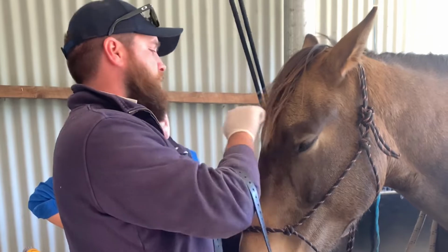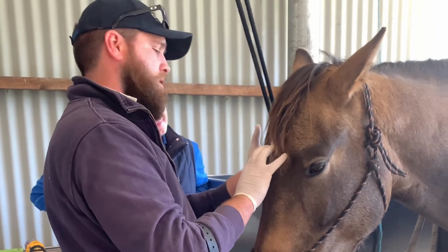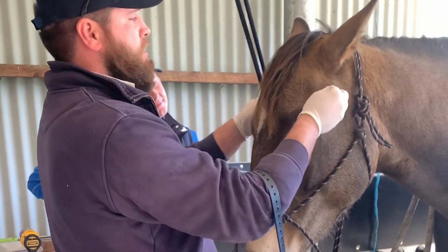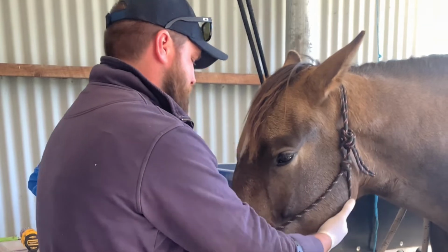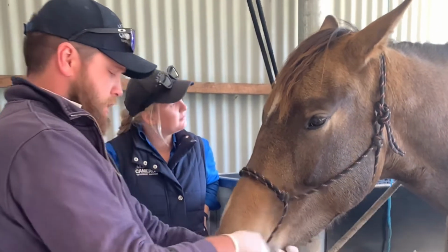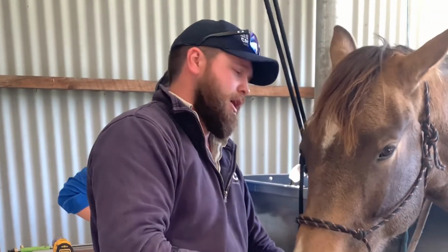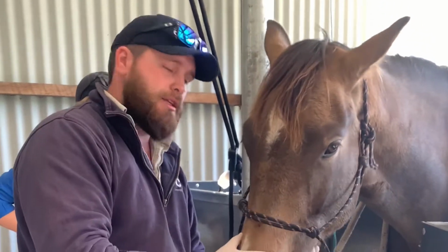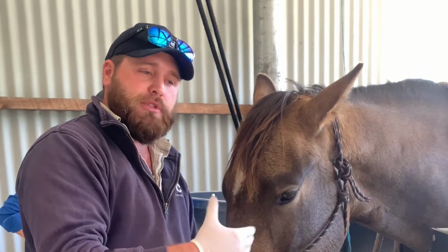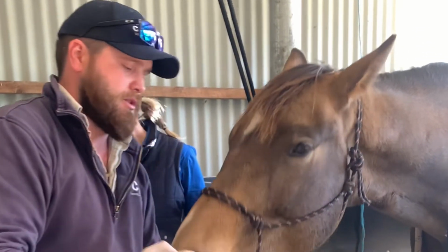I always start off by tapping the sinuses to see if we can hear any dullness that might be consistent with a sinus infection. Are there any swellings on the external side of the face? Temporomandibular joints, up underneath the jaws, eyes, no discharge, nasal cavities, any discharge, and just keeping an eye out for any of those. Some horses will develop swellings underneath their jaw, in particular young horses, and that's common. That's associated with the eruption of the teeth, but is it in the submandibular glands or anything along those lines?